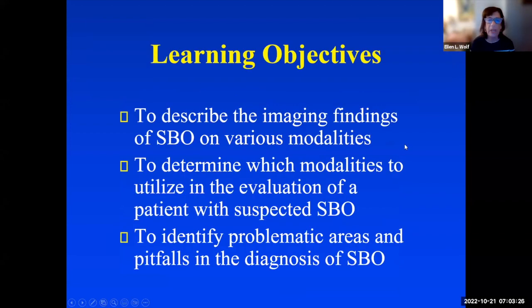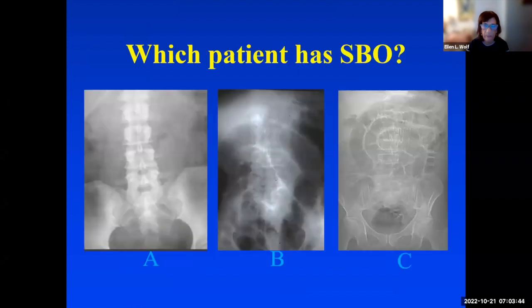So learning objectives for today are to describe the imaging findings of small bowel obstruction on various modalities, determine which modalities to utilize in the evaluation of a patient with suspected small bowel obstruction, and to identify problematic areas and pitfalls in the diagnosis of small bowel obstruction.